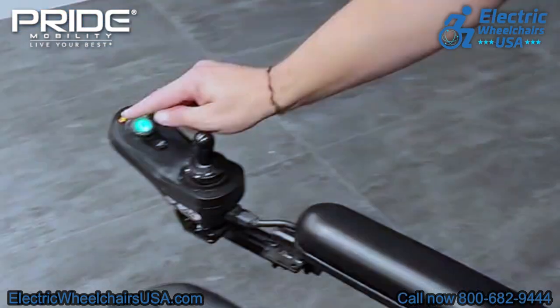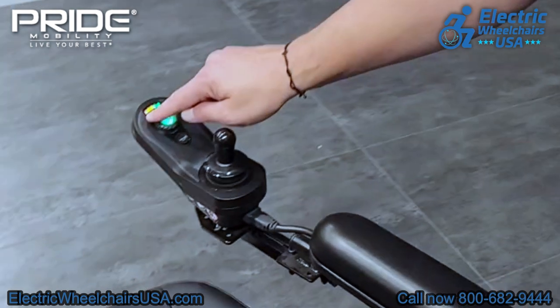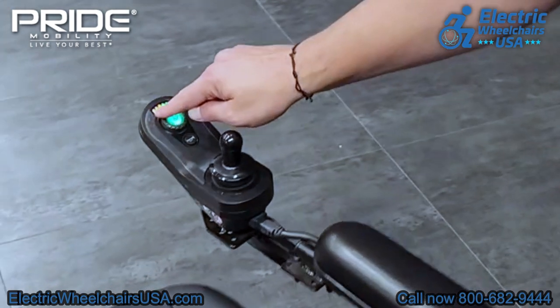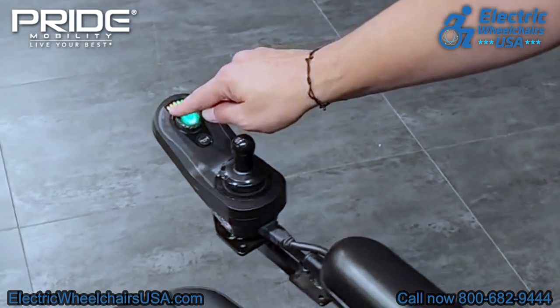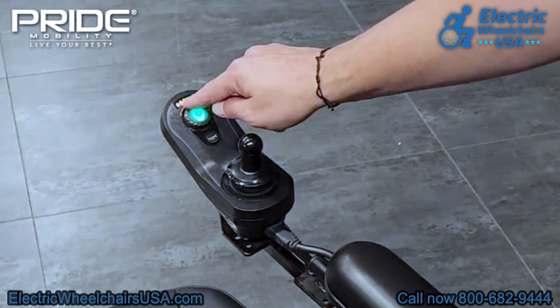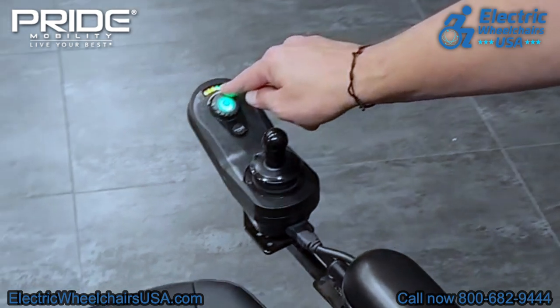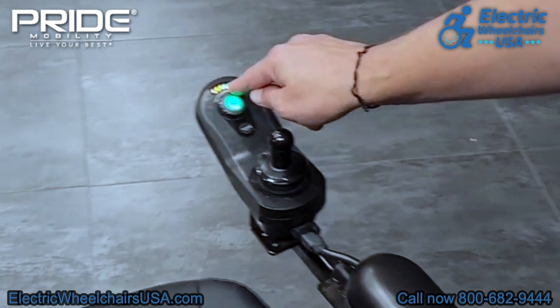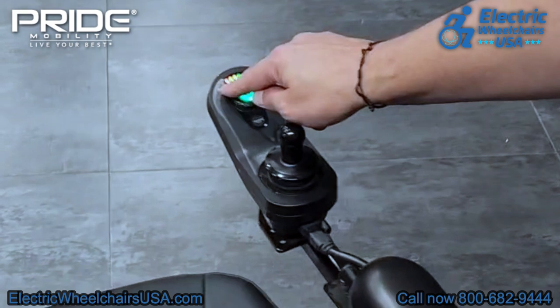The joystick is an intuitive joystick. It has a battery gauge up top where all of these lights are — if all the lights are lit up, it's fully charged. As the battery starts to deplete, each of these dots will disappear. If you get in the habit of recharging your batteries once it gets to about halfway or a quarter of the way charged, that's a good way of increasing the longevity of your batteries.